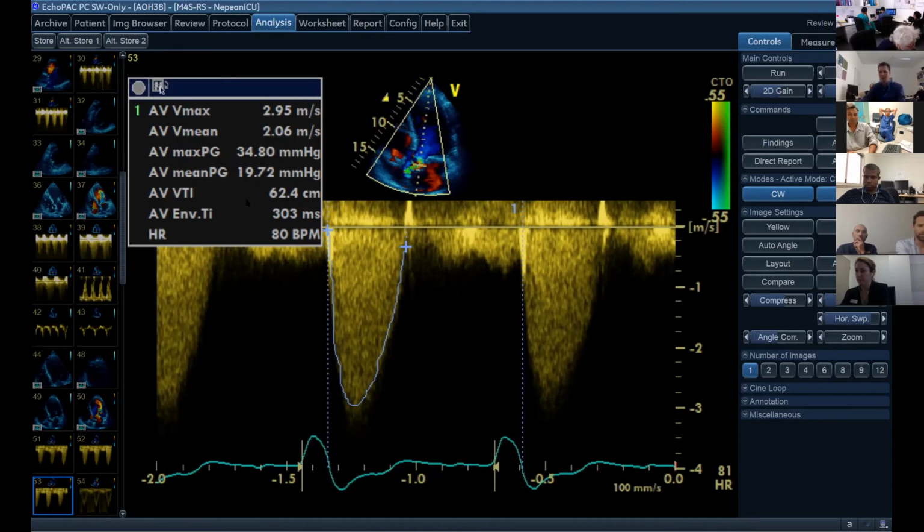Okay. And then that means you can do the LVOT area times by the LVOT VTI divided by the aortic valve VTI to get your 1.6. So I guess that's the thing that we've asked in the exam before. So you'd be expected to be able to do that equation in the heat of battle. I'll probably give you some better numbers than that, but it's the kind of thing that you'd be expected to do for the aortic valve, mitral valve. Would probably be the 2 big ones. We might ask you to do that equation on the spot. Okay.